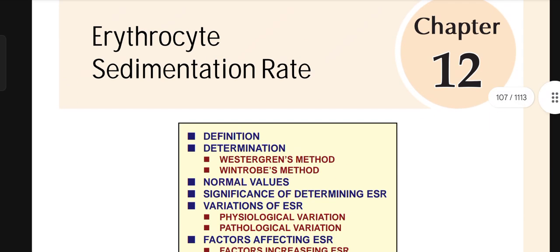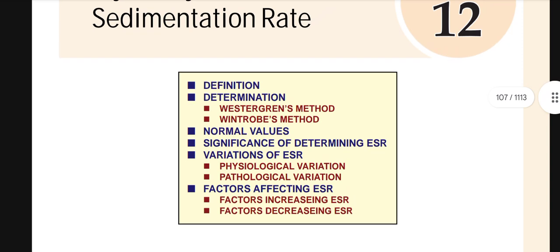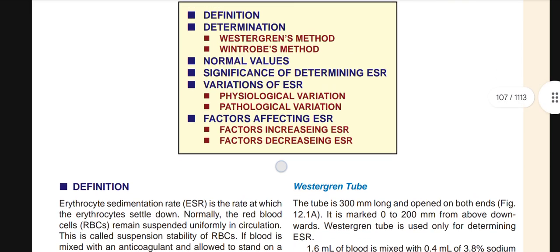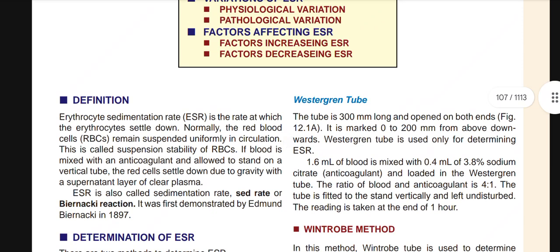Today we will discuss the definition, determination methods, normal values, significance of determining the ESR, variation of ESR, and then factors affecting ESR. So let us start. First of all, what is the definition of ESR?